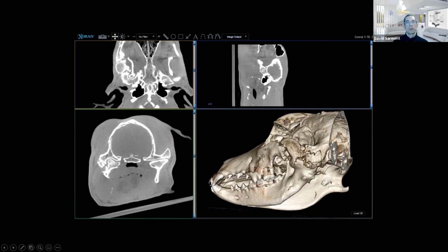An interesting view of a temporomandibular joint, which obviously has significant pathology, probably due to past trauma. Yet you can appreciate whether there is a ligament or not. And if you wanted to approach this surgically, you can, because you have all the details. You know you're going to find a ligament space. You know how far you can go if you wanted to surgically remove all of that. You also know how far you should not go because the brain is right behind it.